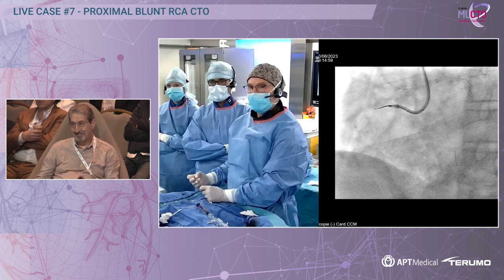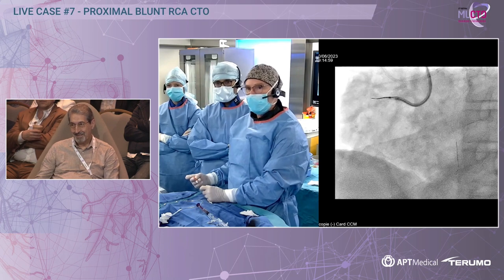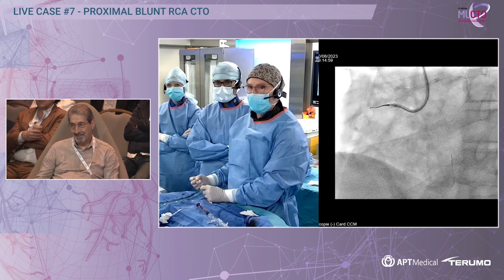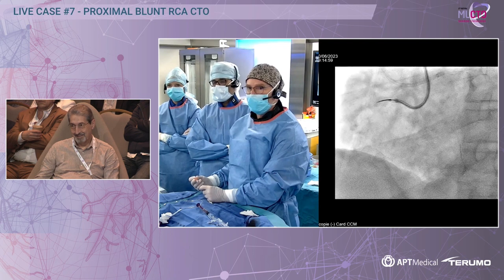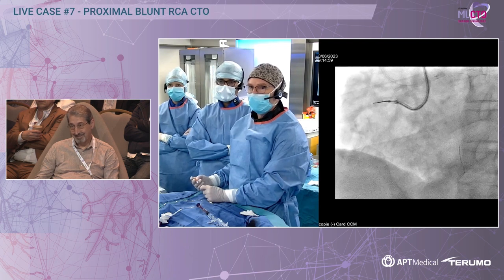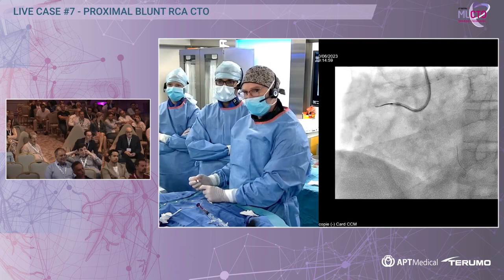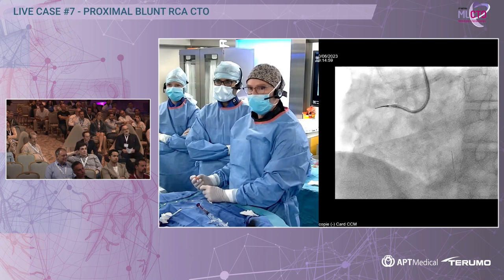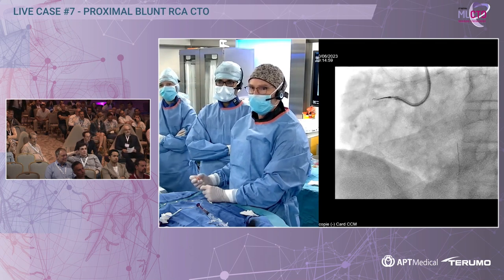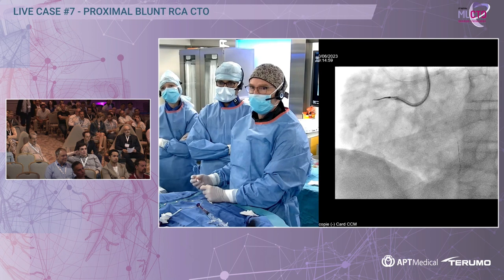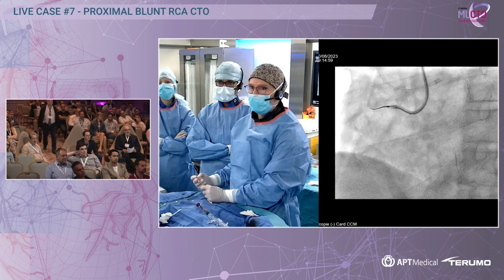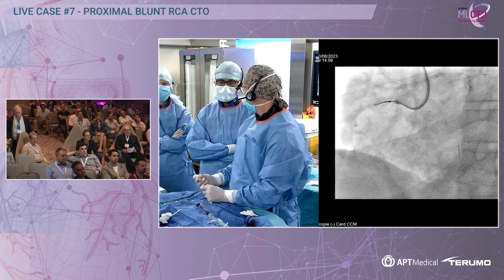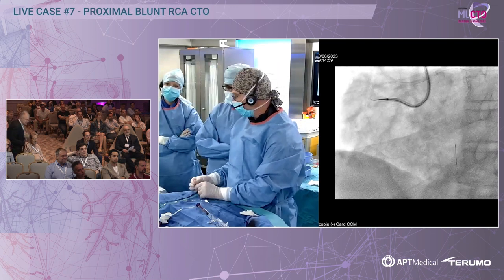You can see how the tip of the Gaia reacts — it wants to knuckle. It's hitting something hard. I'm trying to direct it inside but it's very difficult. So I think in that case a polymer-jacketed wire will be my choice now. If you agree, we'll take a Gladius.